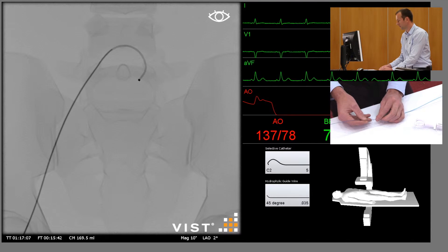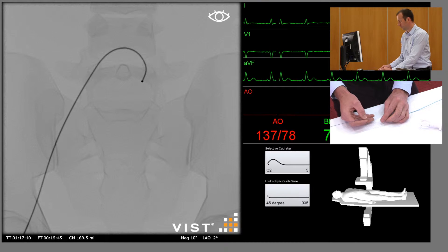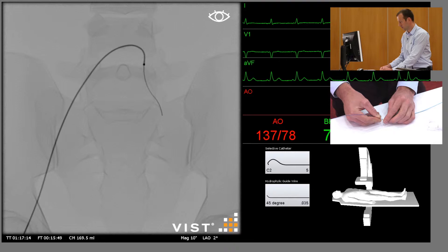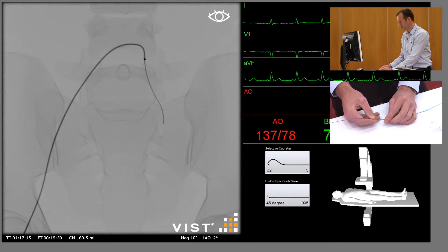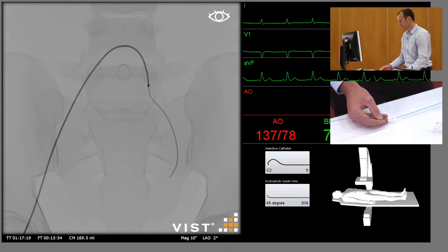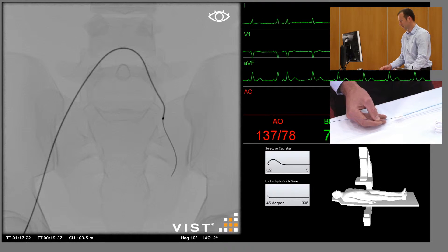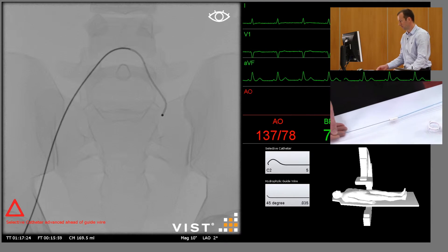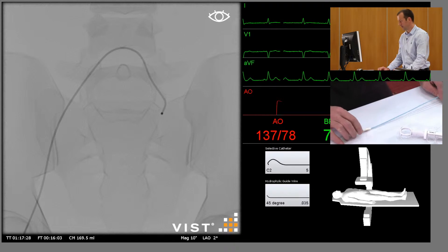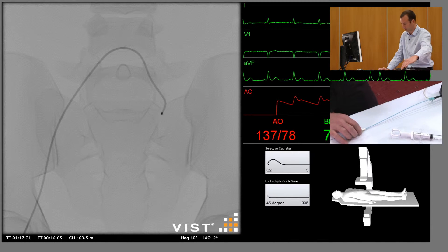Reinsert the guide wire again very carefully as you get to the tip, and select the internal iliac artery. Again remove the guide wire, and at this stage we need to identify the bifurcation into the anterior and posterior divisions.